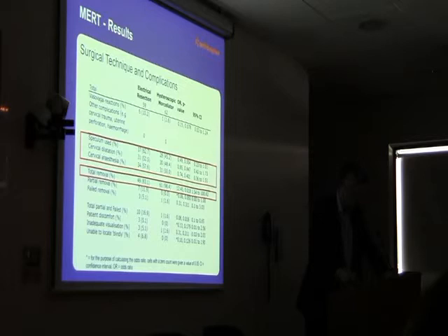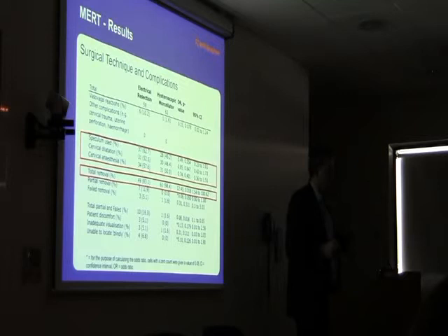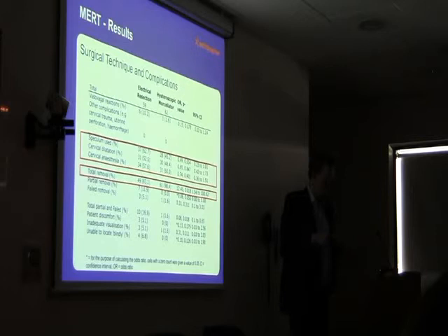And then this is the slide that I think is the most compelling evidence to me. In the OPT trial, we showed exactly the same data as here. In the OPT trial, 18% of polyps we couldn't fully remove. What I mean by that, you might get a bit of it off, you might cut it off, but you wouldn't retrieve it. So you had to remove the whole polyp successfully, and you had to retrieve it from the uterine cavity. If you didn't do that, we considered it a failure. In the OPT trial, it was 82% success, so 18% failed.